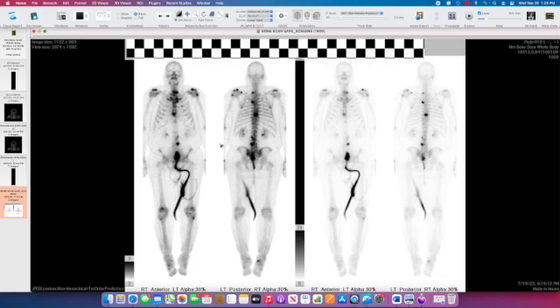An additional abnormal focus is noted in the left humeral head here, which we see on the patient's left. This is the anterior view and the posterior view.